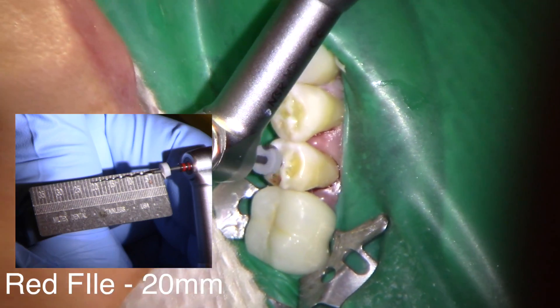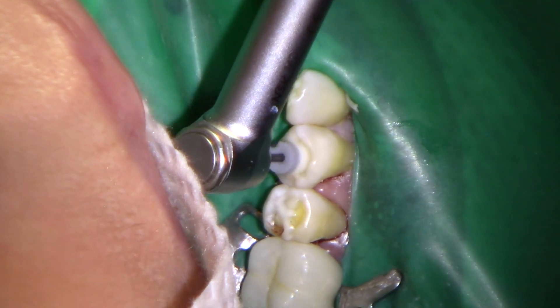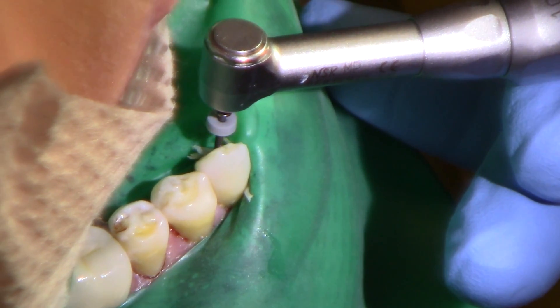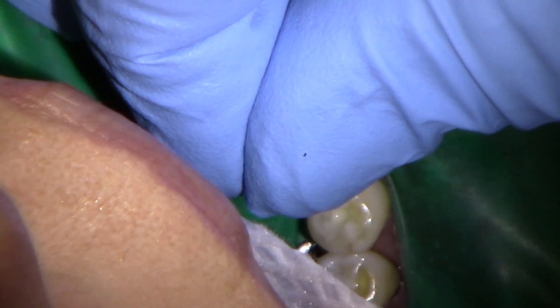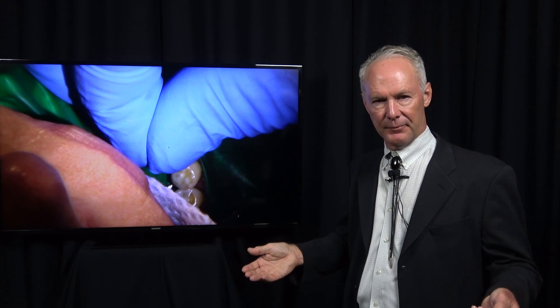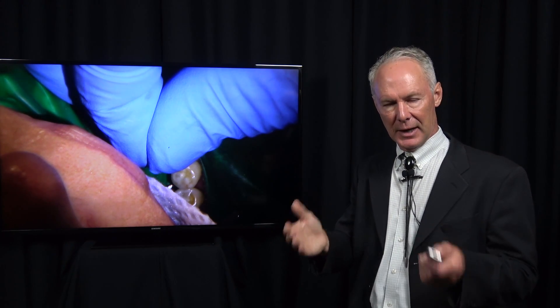Now the red file is the 25. So I've done the 40, now I'm back to the 25. Hopefully with the 25 I'm going to depth. Once I've done that, I irrigate it out. Now I'm going back with my Hedstrom file — this has been very light pressure — and I'm cleaning the apical part of the canal to be sure all that debris is gone. Just in case a file is separated, it's going to be okay 99% of the time. You don't have to go back and remove that separated file 99% of the time.